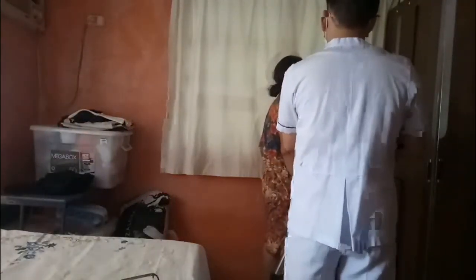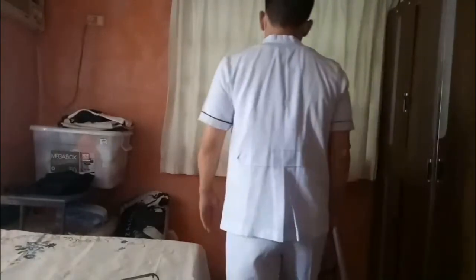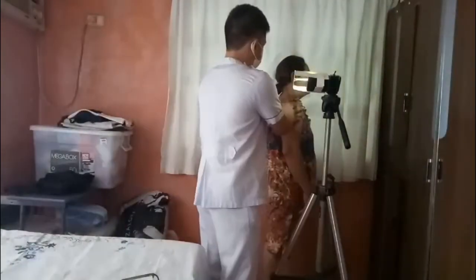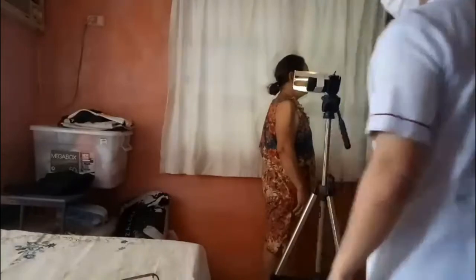Position of the part. Center the coronal plane that passes through the mastoid tips to the midline of the IR. Move the patient close enough to the vertical grid device to permit the adjacent shoulder to rest against the device for support. Rotate the shoulders anteriorly or posteriorly according to the natural kyphosis of the back. Adjust the shoulders to lie in the same horizontal plane. Depress them as much as possible and immobilize them by attaching one small sandbag to each wrist. Be careful to ensure that the patient does not elevate the shoulders.